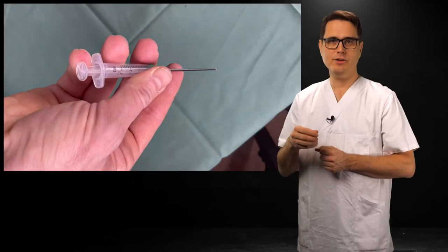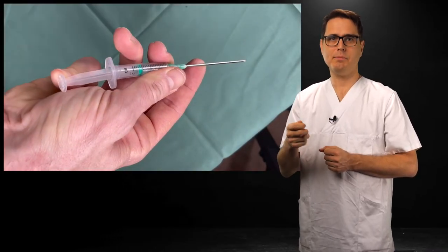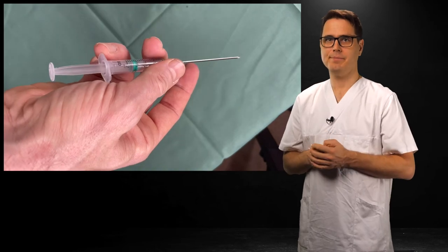Continuous aspiration is not necessary, but you may want to aspirate when you've punctured the vein. Use the handle grip and pull out the plunger with your pinky. It takes a bit of practice.